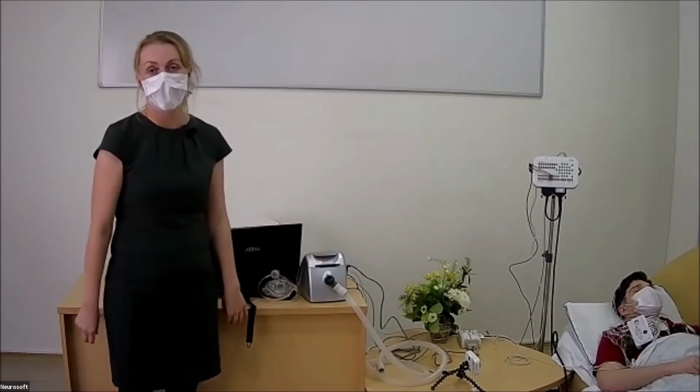But there are different types of devices and systems, and auto-titration CPAP devices, auto-titration PAP devices, exist.